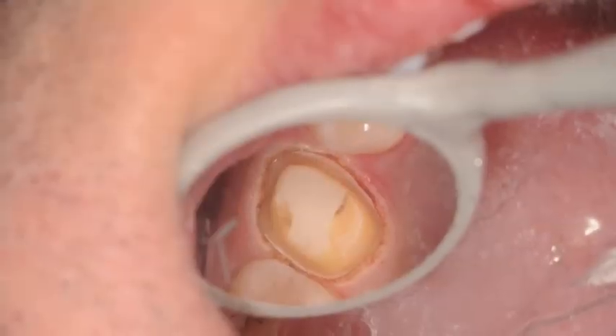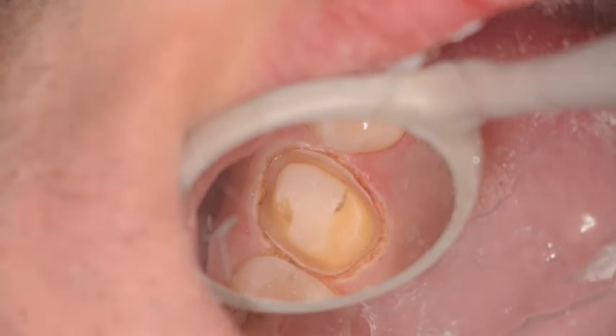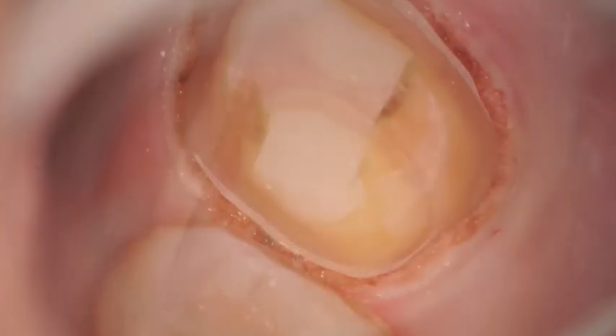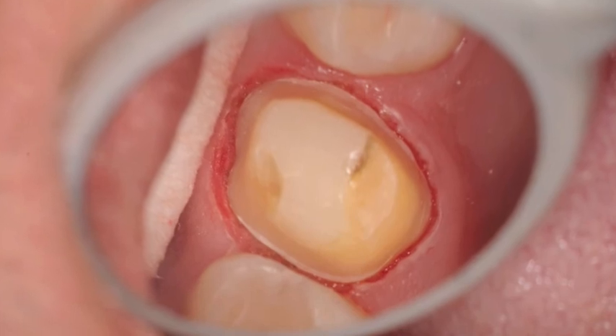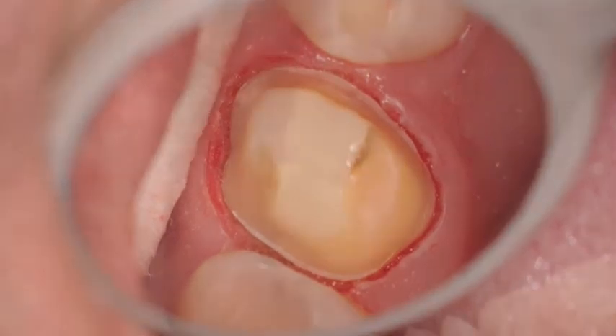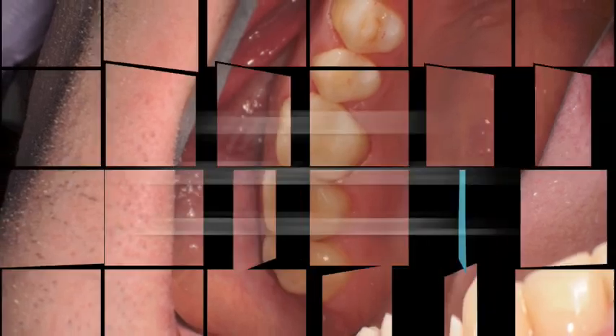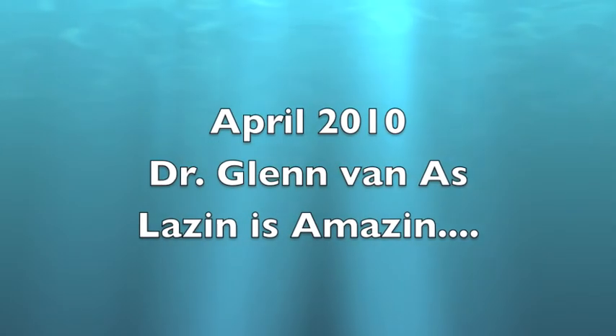You'll now be able to see the stills of the final procedures, both at low and high magnification, before the impression was taken. Here's a clear view after the impression was taken, and finally with the provisional in place. This is Dr. Glenn Vanasse saying goodbye and keep lazing — it's amazing.